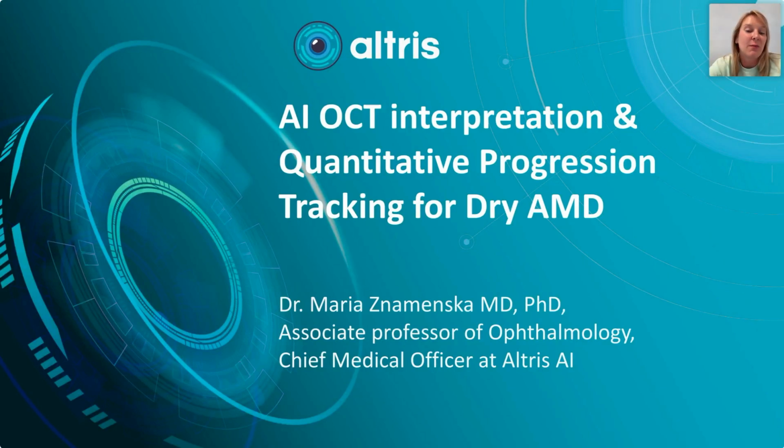Let's talk today about AI OCT interpretation and quantitative analysis progression tracking for dry AMD. Are we going to talk only about dry AMD? Well, let's see how it goes.